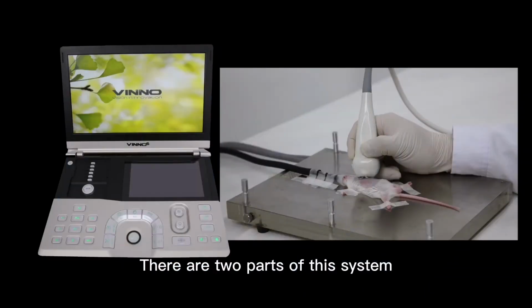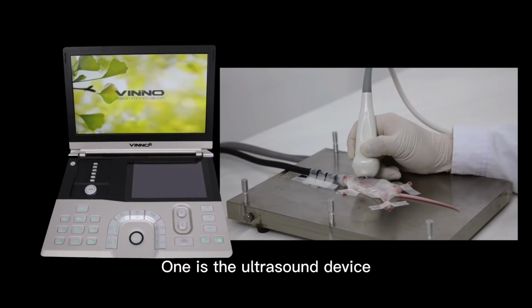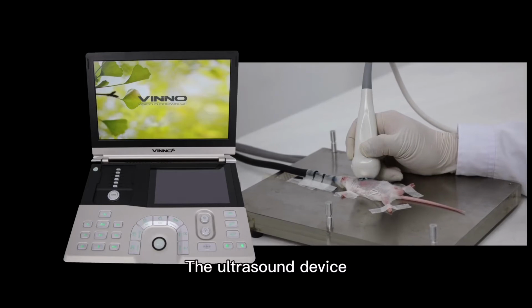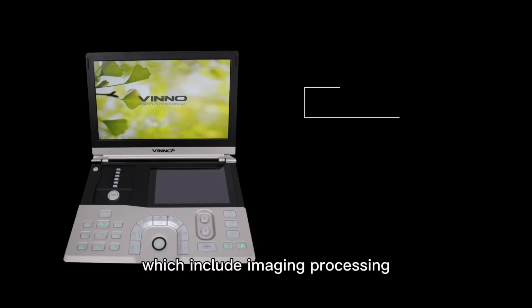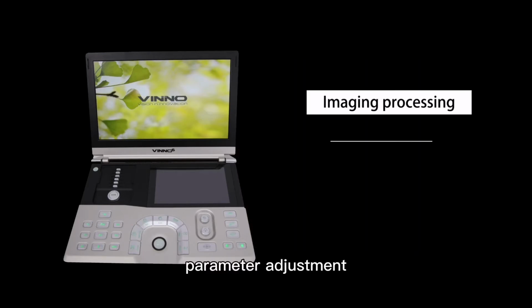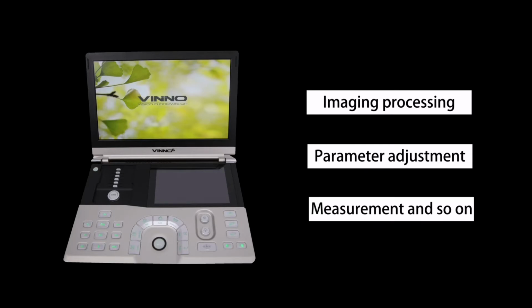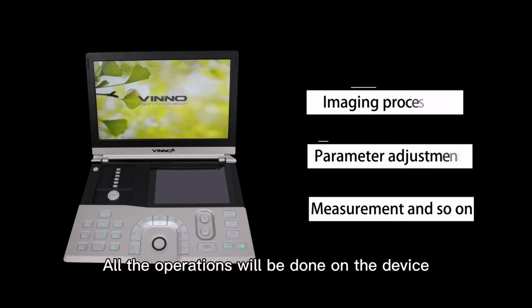There are two parts of this system. One is the ultrasound device. The other is the probes. The ultrasound device, which includes image processing, parameter adjustment, measurement, and so on. All the operations will be done on the device.